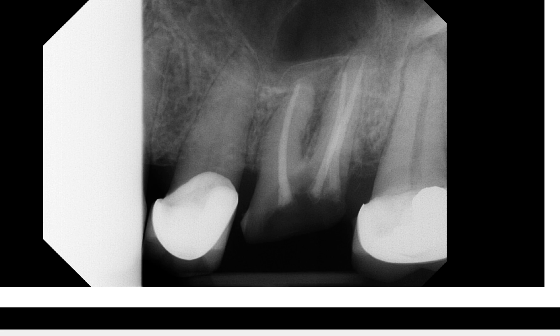But let's take a moment to look at tooth number 15. We do see a large crown — looks like a PFM — and how would you assess the periapical area?